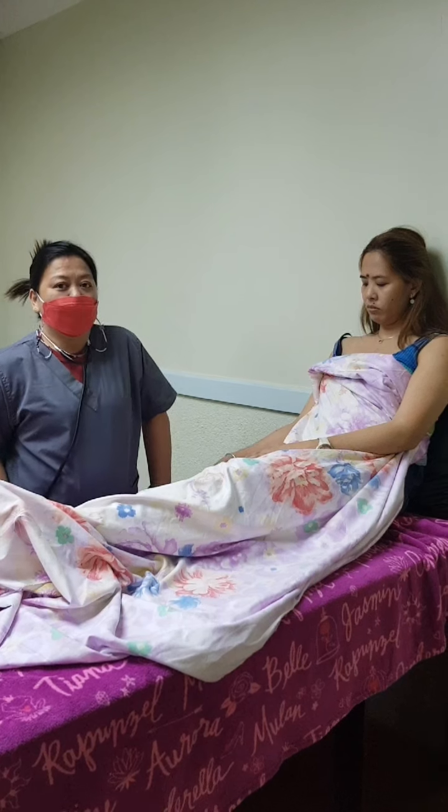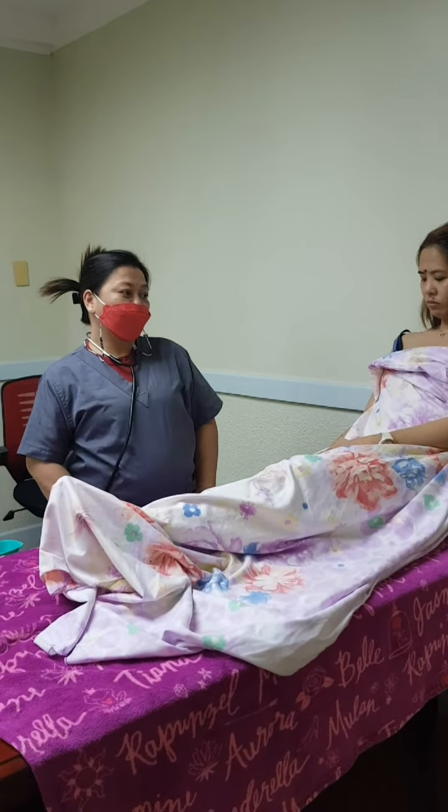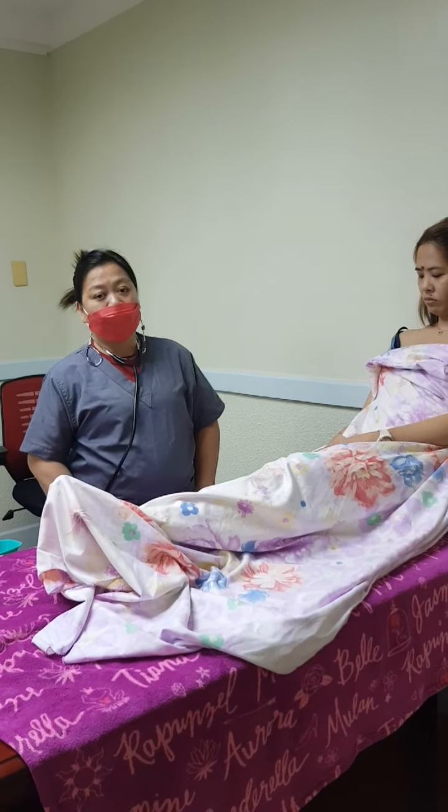I will perform a return demonstration on how to insert a nasogastric tube. The nasogastric tube method is introducing a tube through the nose into the stomach.